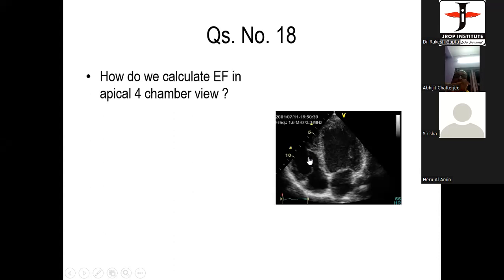Is that what we taught you? Doctor, have you been reading, or have you got mixed up with all the information that we gave you? I don't know exactly, sir. We told you to measure at the base, then at the mid cavity, then there's a longitudinal diameter. Are you aware of this? Yes, sir. Mid cavity, sir. So if you want to take these measurements, will the heart be in diastole or systole? Systole, sir.